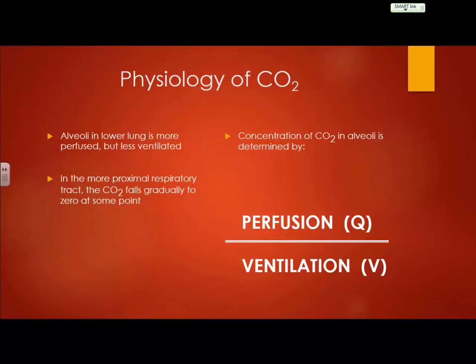Why are they less ventilated? Because of dead air space, remember that? And remember that when you're breathing in, you've got around 150 milliliters of air that hangs out in that dead air space that you lose, and then you lose more of that pressure as you go down. In the more proximal respiratory tract, CO2 falls gradually to zero at some point, and we're measuring the CO2 as a whole. If we were to measure the individual areas of the lungs, they may be a little bit different as we're expiring out. It doesn't really matter, though, because what we're doing is measuring it as a whole.